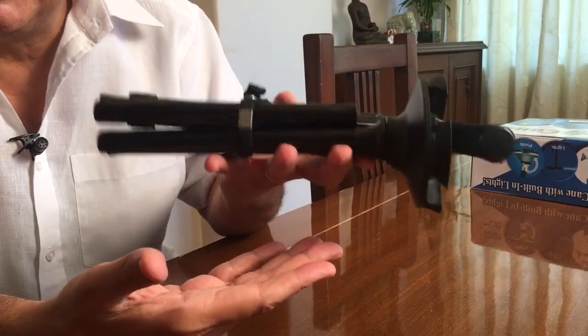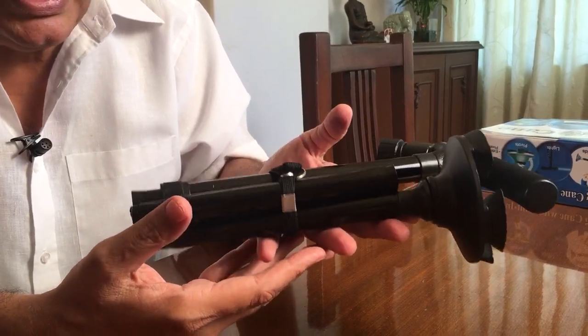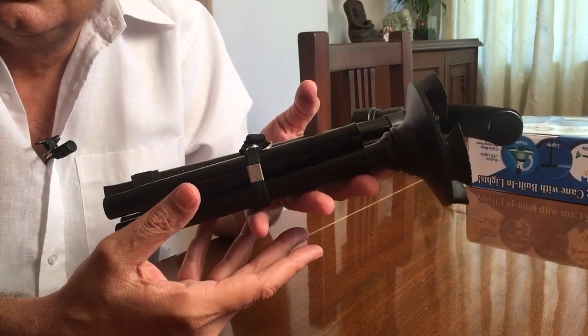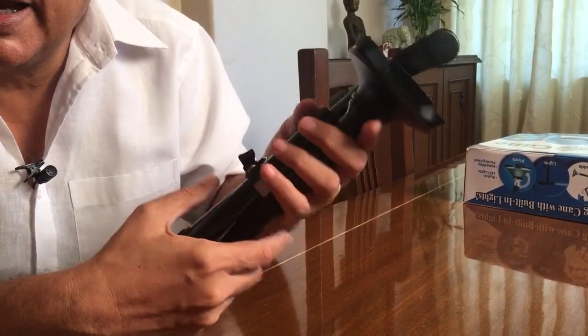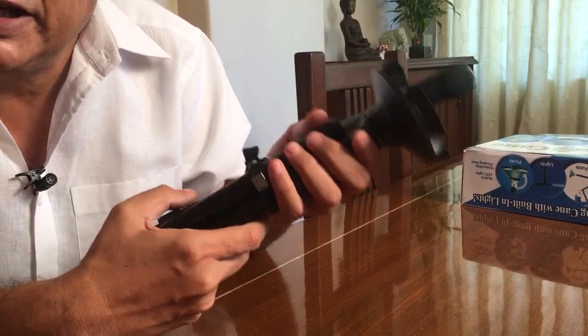The second feature is that it is very light. The whole cane must not be weighing more than maybe 300 to 400 grams at the max, so therefore for an elder to use this cane it becomes very easy.